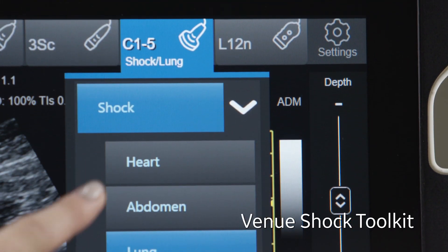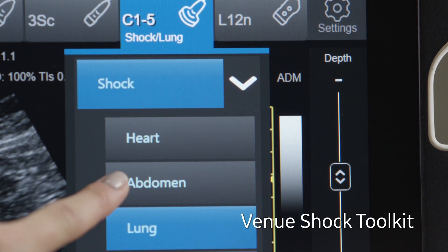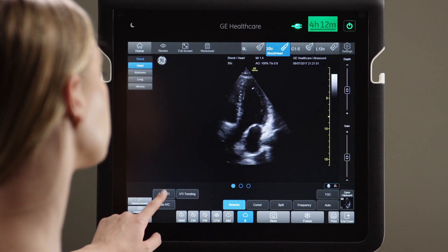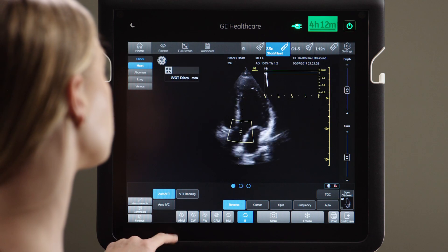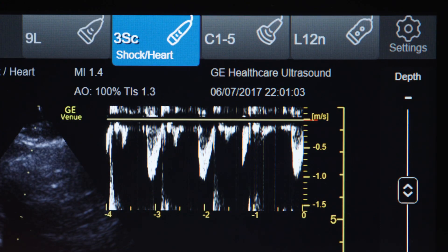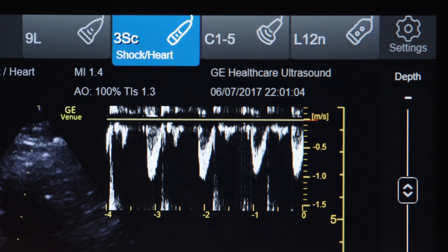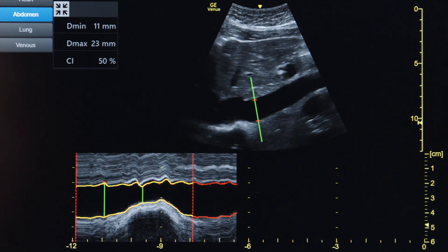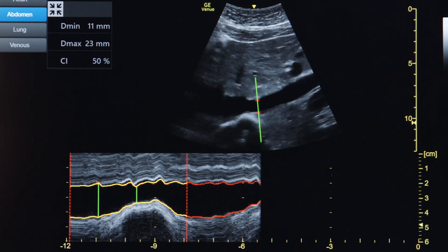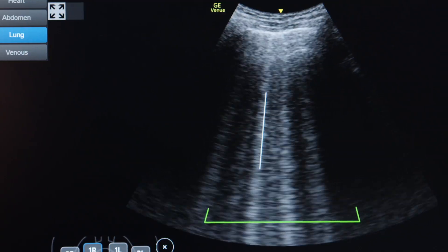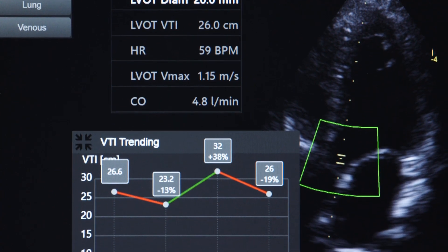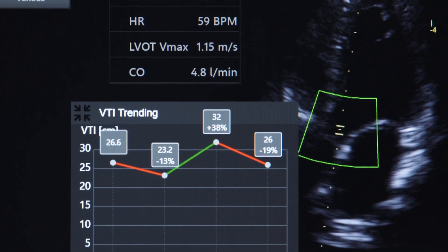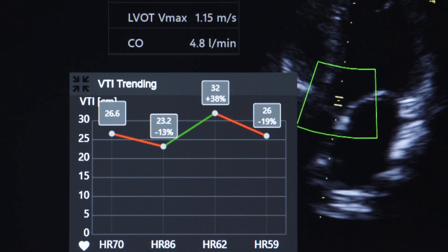Venue's Shock Toolkit is a set of features that focus on some key indicators of patient status – the heart, lungs, and IVC. It assists you in gaining insights needed to help in the determination of the cause of shock.